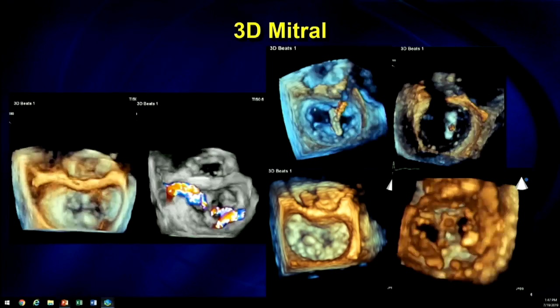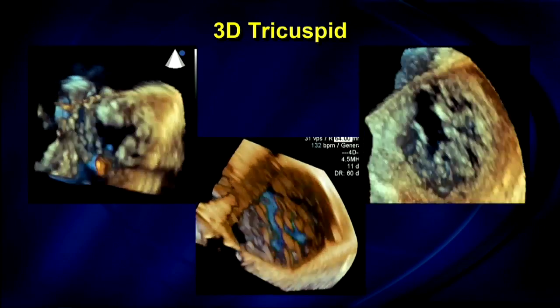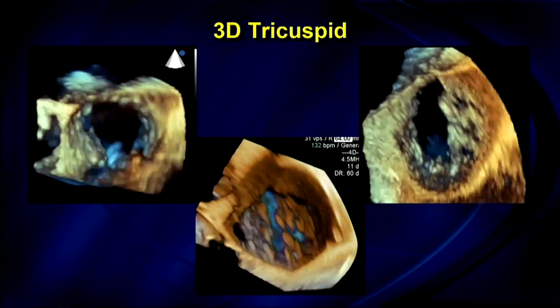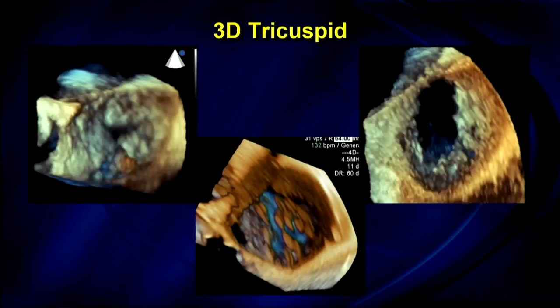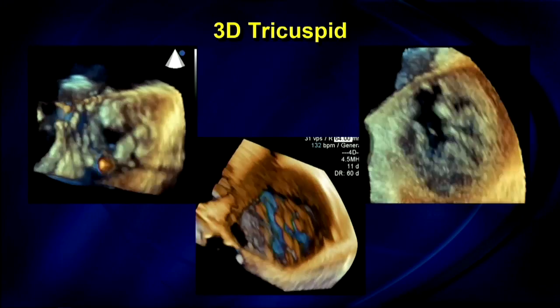But when you try to go to the tricuspid valve, 3D is not as good. And every once in a while you get some nice images, but you get these moth-eaten leaflet appearances, and sometimes you get images like the bottom. It's kind of like a nuclear study. I'm just kidding.